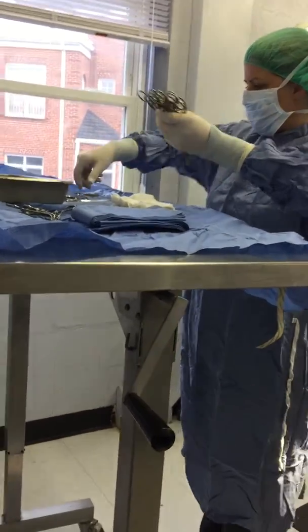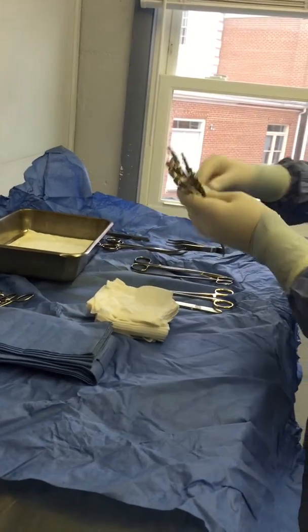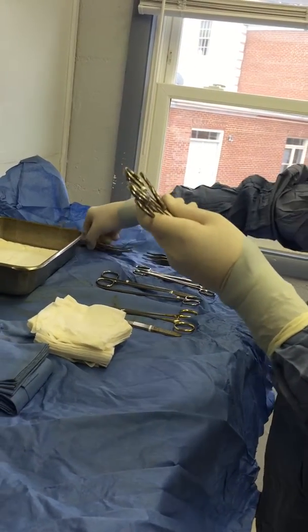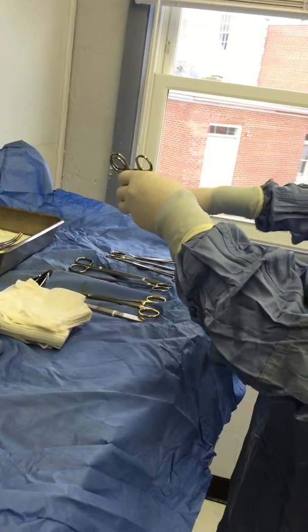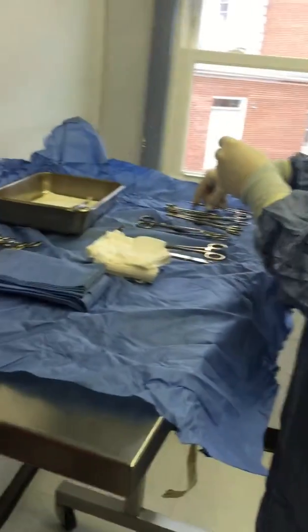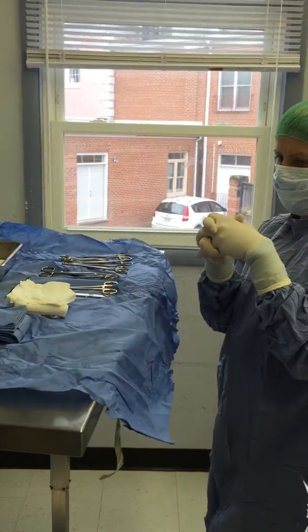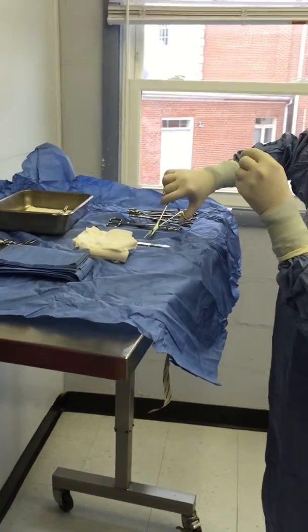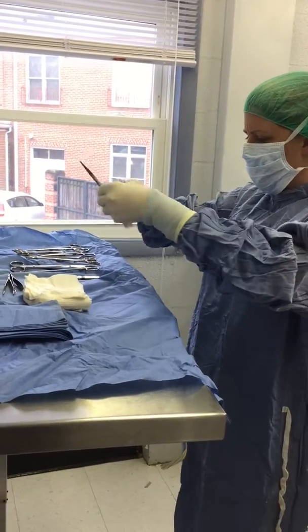Allis tissue forceps probably won't be needed for this procedure. If I could have Nicole open my blade for me, that would be awesome — just grab a tiny blade. I'm going to put my blade in here and needle driver in here.